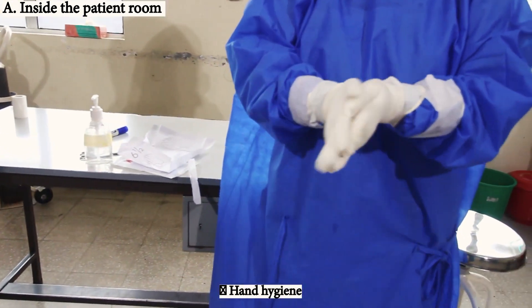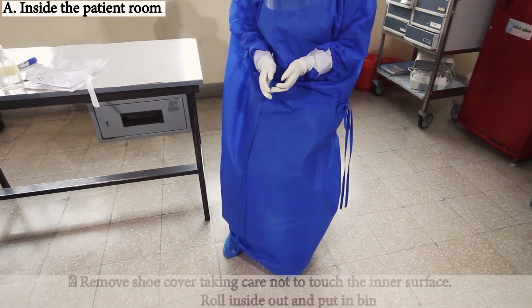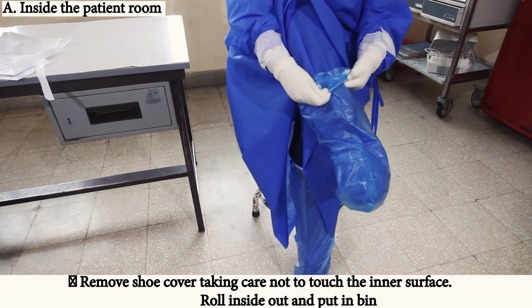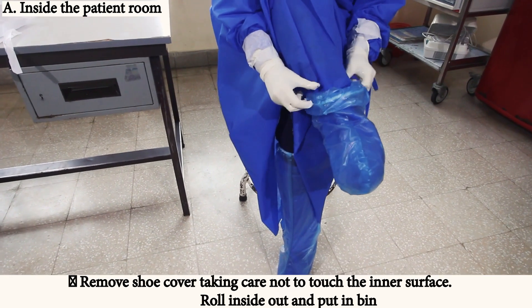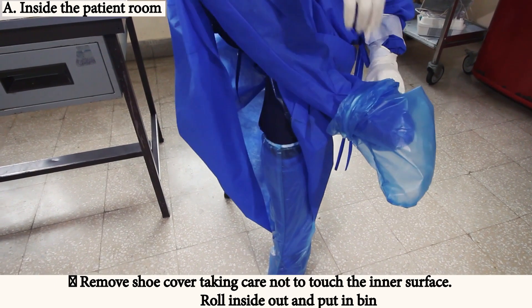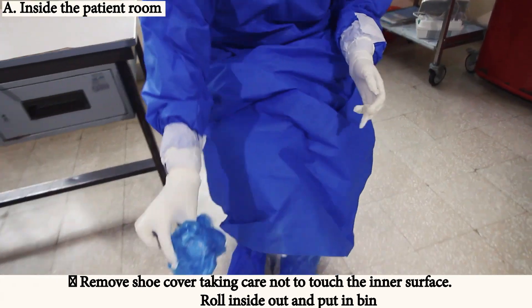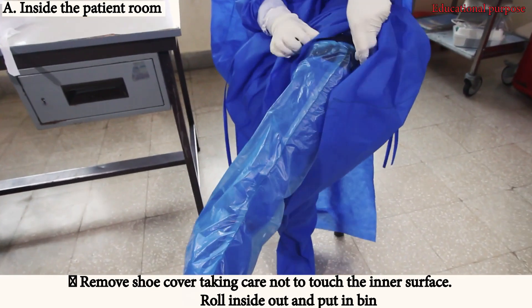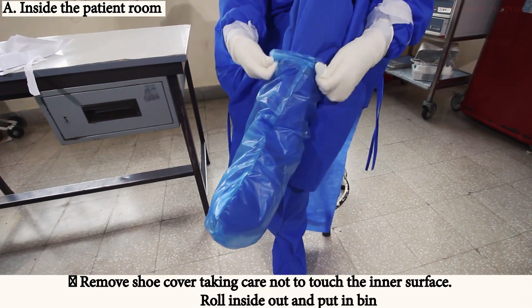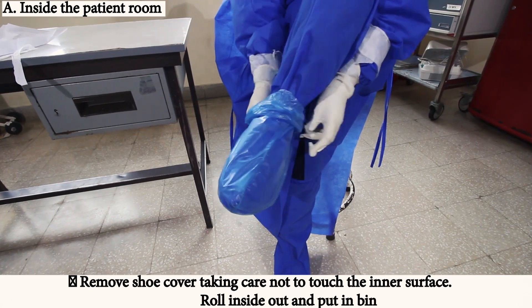Perform hand hygiene again. Remove the shoe cover taking care not to touch the inner surface. Roll it inside out and put it in the bin. Then remove the second shoe cover.